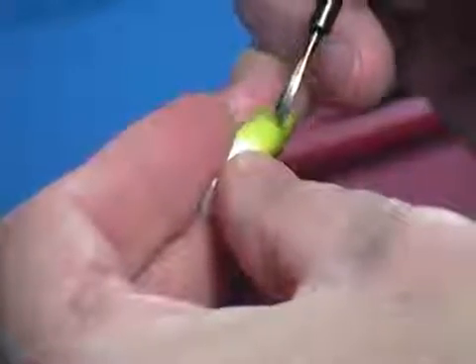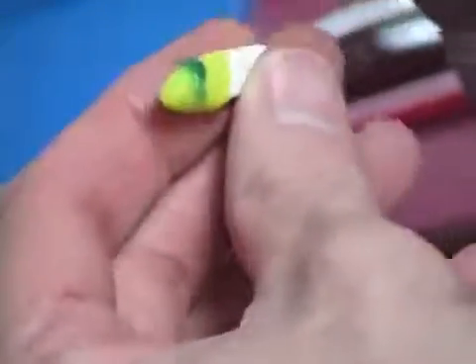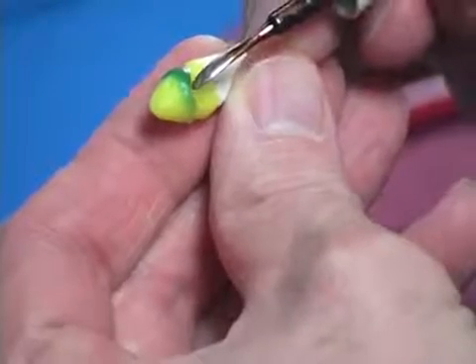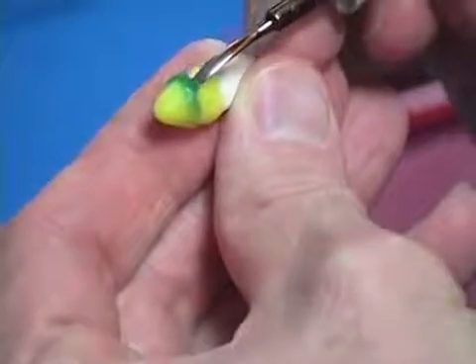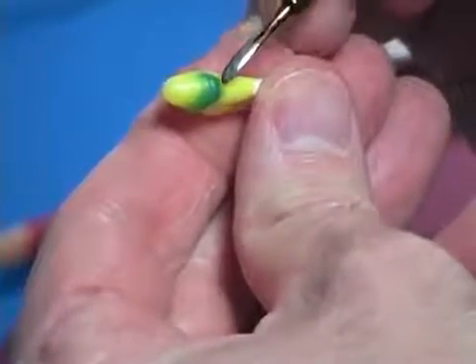Re-wet the dip wax along the margin of the die with a hot number 7 spatula using short back and forth strokes. Do not add or subtract wax in this area. This readapts the wax, giving it an excellent adaptation to the margin.